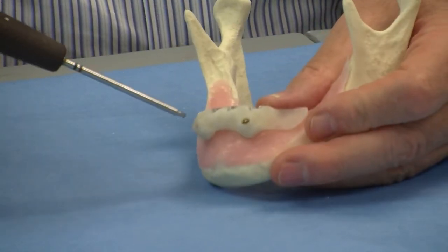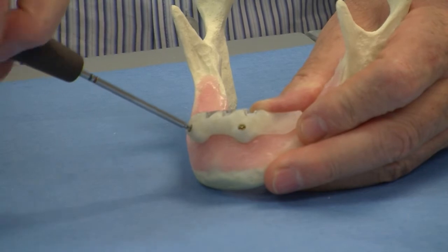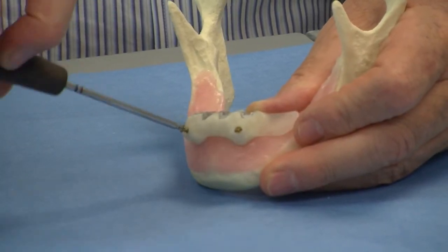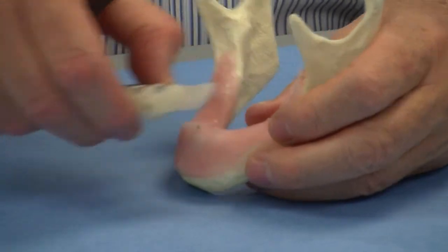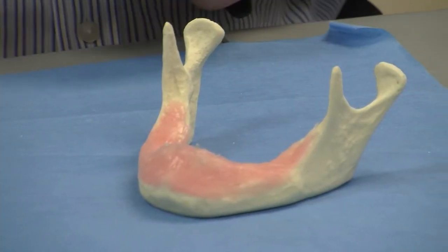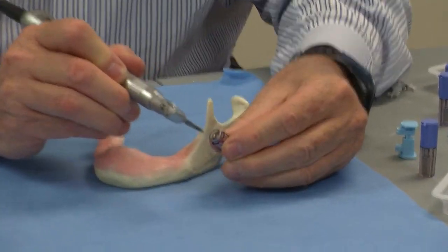We can then remove the frame. And we're ready to insert the implants. We are now ready to insert the first 2.9mm implant.